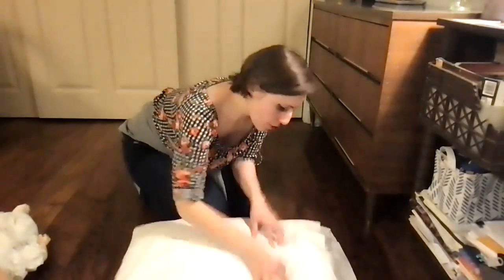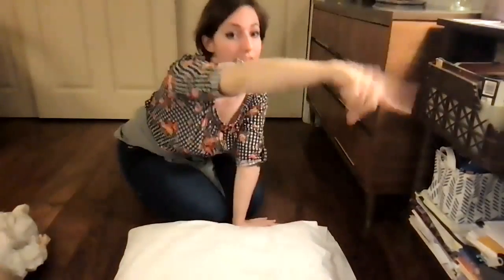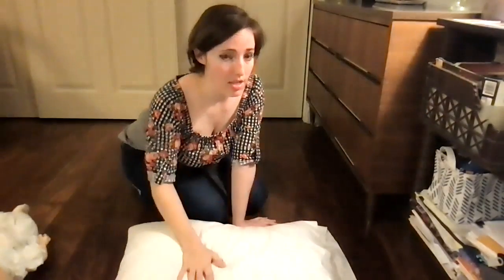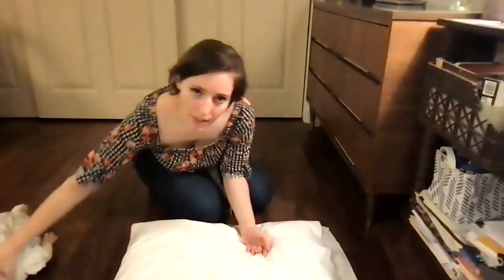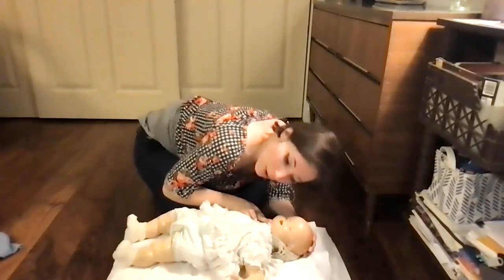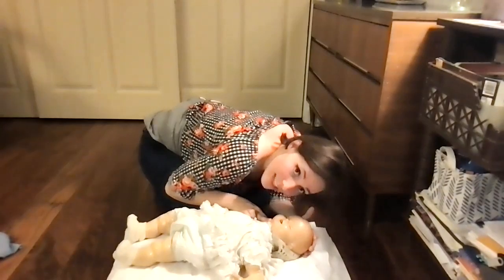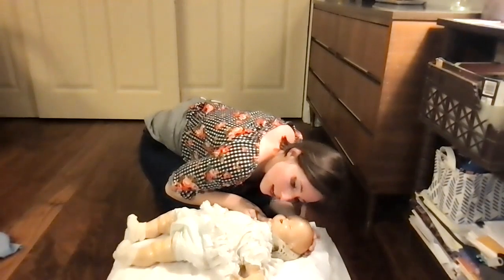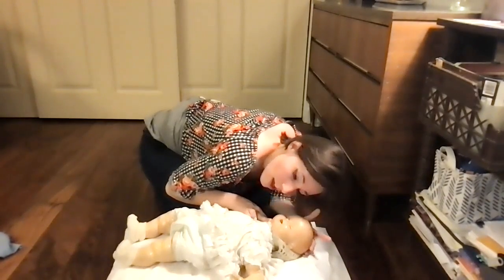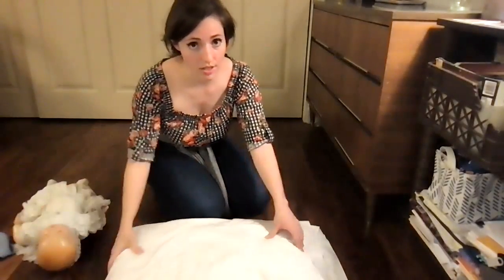So what it's going to look like: hey, are you awake? Are you okay? Sir, ma'am, are you okay? No response. Hey, you, call 911. You go get an AED. Get back to me. This person's unconscious. Then you're going to feel their carotid pulse as you look down their chest for 10 seconds, seeing if you see any chest rise and fall. If you don't, then you're going to start chest compressions.